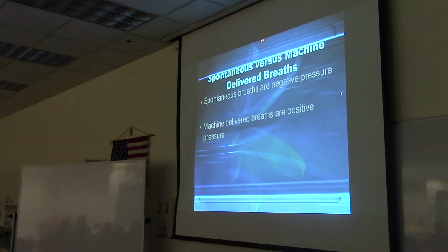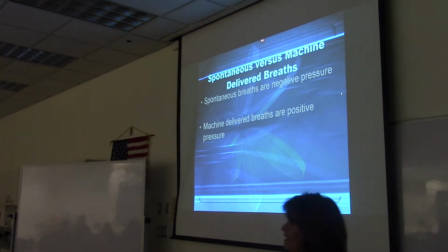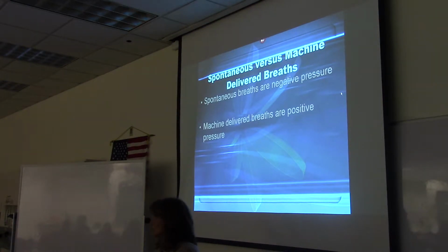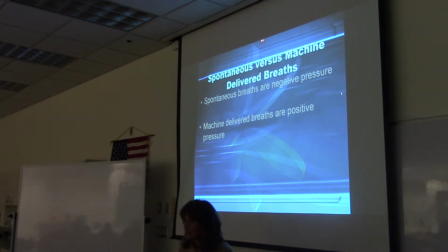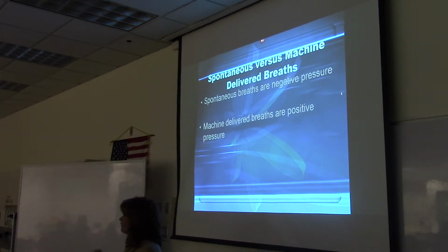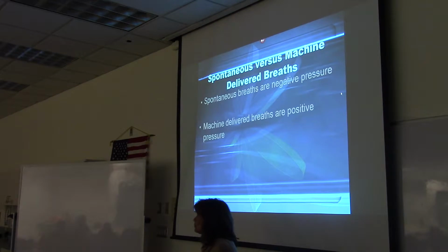All right, breathing with a ventilator is not what's normal physiologically for our bodies. When we breathe normally, we create a negative pressure in our lungs, and that negative pressure is what pulls air into our lungs. Somebody who's not breathing or not breathing well enough, and we have to breathe for them, we push air into the lungs. So we use a positive pressure, and that's not physiologically normal.